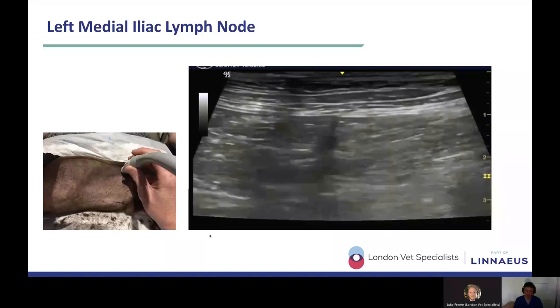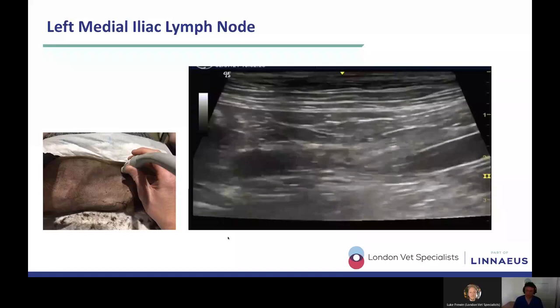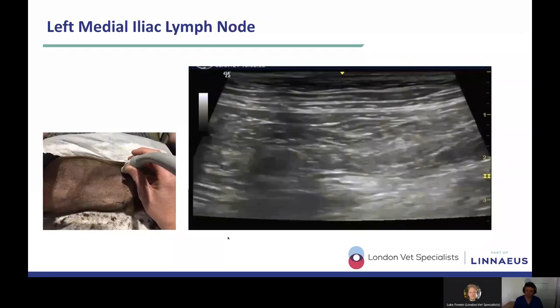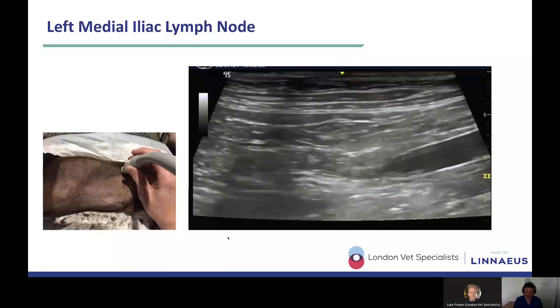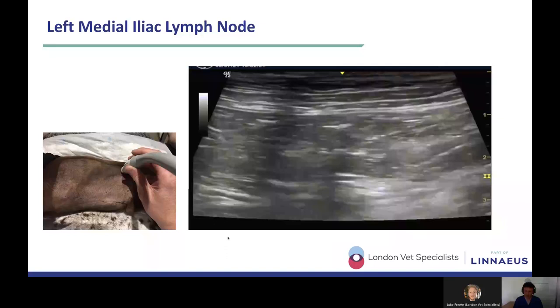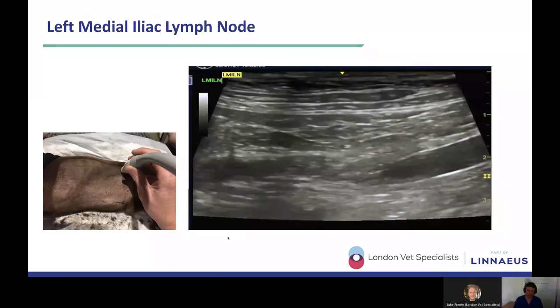But it's super important to get used to looking for those medial and internal iliac lymph nodes, because when they're abnormal, they can be exceptionally abnormal. They can get very, very large indeed. And sometimes you'll find very large medial and internal iliac lymph nodes in patients where you wouldn't necessarily expect to find them. So I've had a number of patients that have presented for other reasons, say suspected gastrointestinal disease, and I found big medial and internal iliac lymph nodes. And on closer inspection, it turns out that the patient actually has a mass associated with the anal glands, and it turns out that they have an anal gland adenocarcinoma.